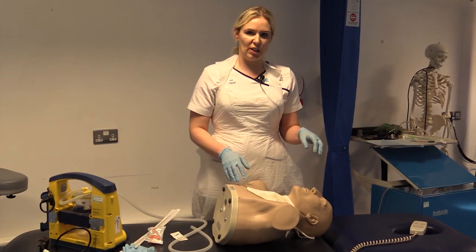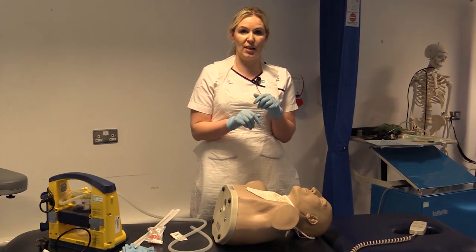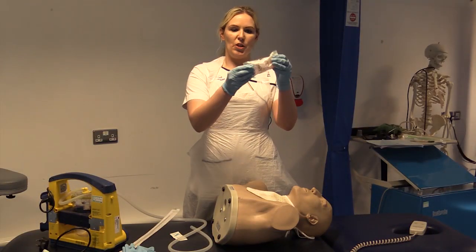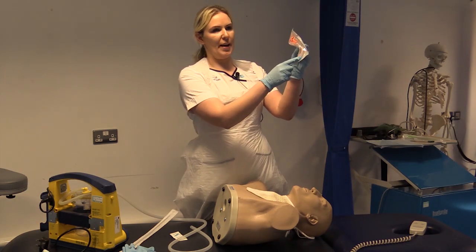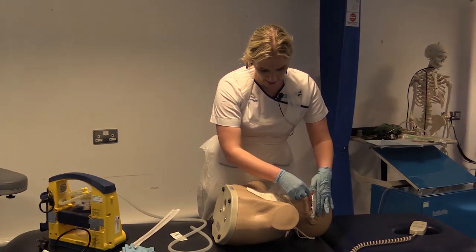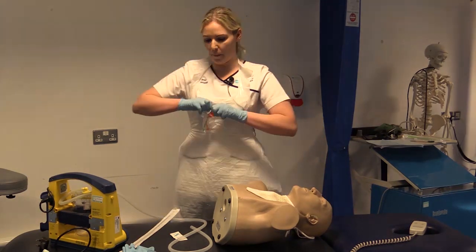You're going to pre-oxygenate for about 2 to 3 minutes before your suction, and just before your suction you're going to check your clinical obs just to make sure they're satisfactory before proceeding. So the first thing we're going to do is choose an appropriate sized airway. So to do that, you measure from the tip to the end of the airway, and we go from the mandible to the lip. Okay. And the end of the airway should be in line with the lip. Okay. So again, we're going to insert our airway. So we just open our packet.